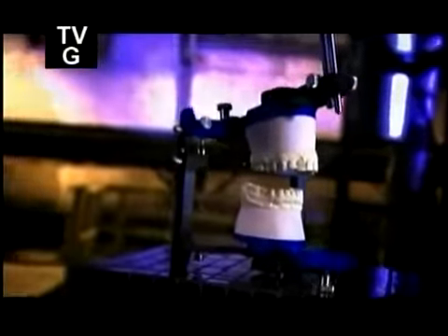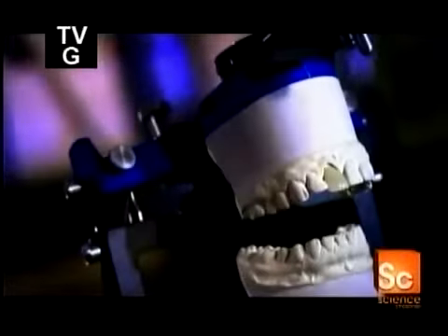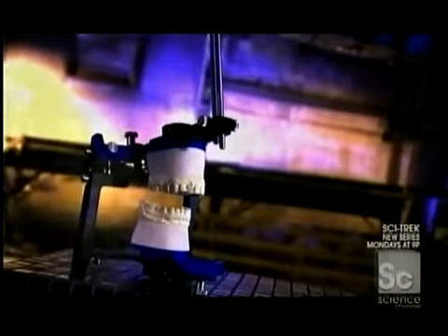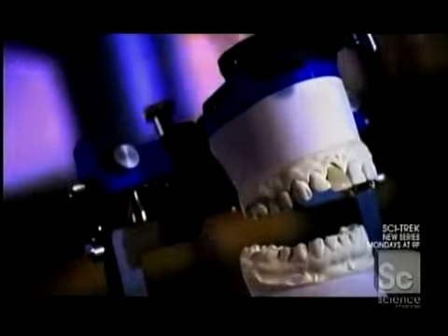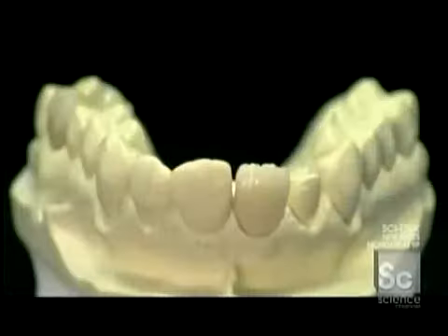Dental work dates back to ancient Egypt, when people used animal teeth and pieces of bone to replace their own teeth. It couldn't have been pretty, but today, high-tech dental crowns can transform damaged teeth into pearly whites that look just like all the rest. A dental crown starts with a plaster impression of the mouth.